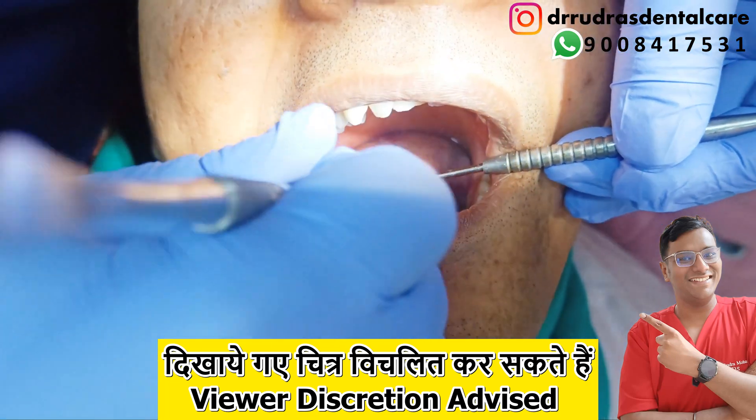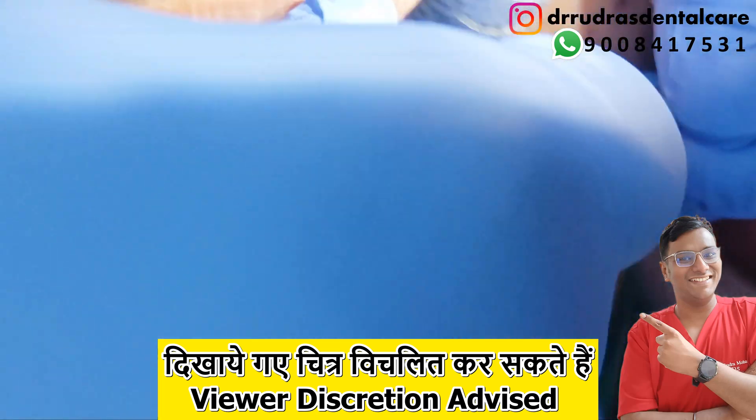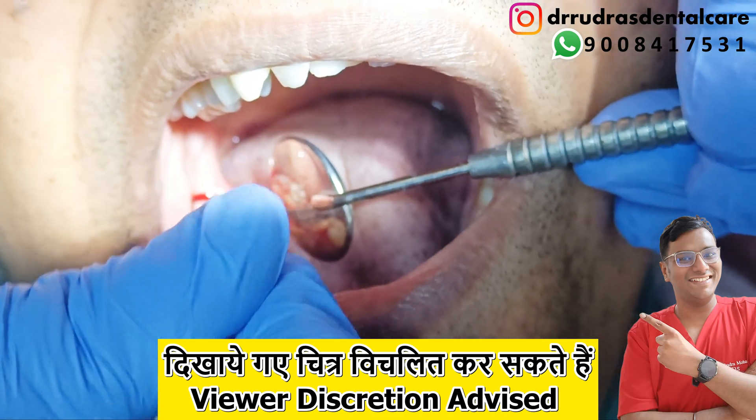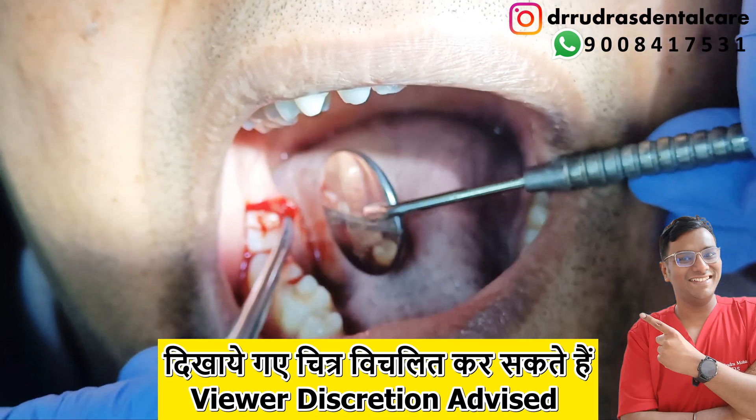This procedure is completely carried out under local anesthesia and a full thickness mucoperiosteal flap is raised. The patient is not undergoing any sort of pain, but just pressure sensations while we reflect the mucoperiosteal flap.